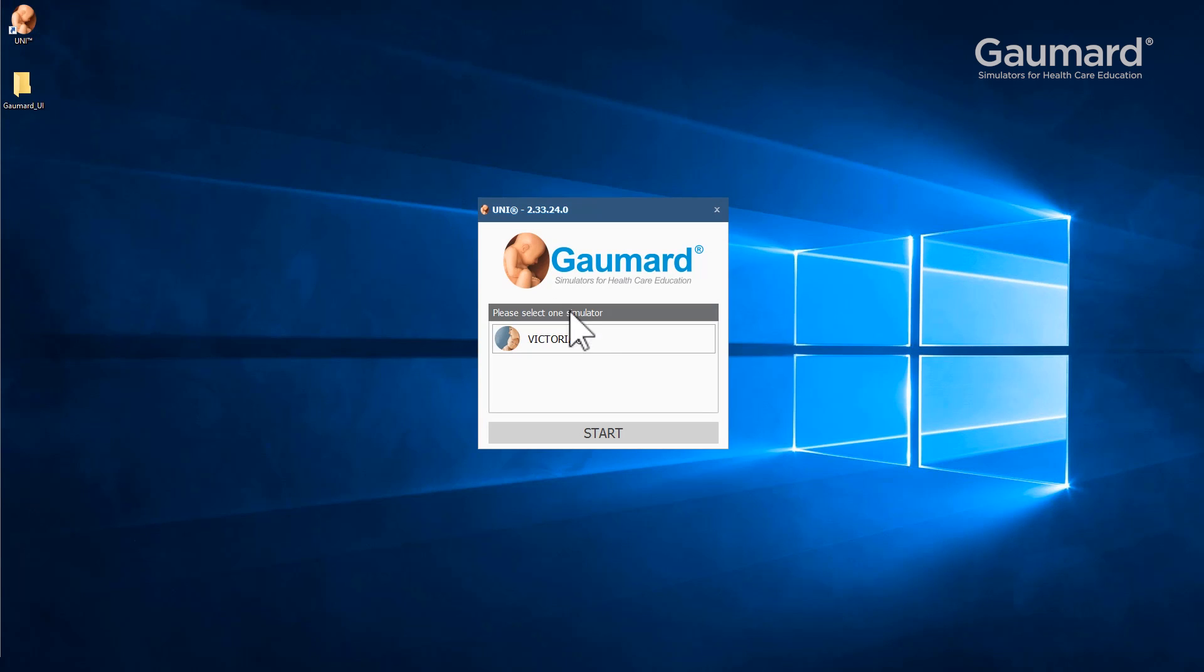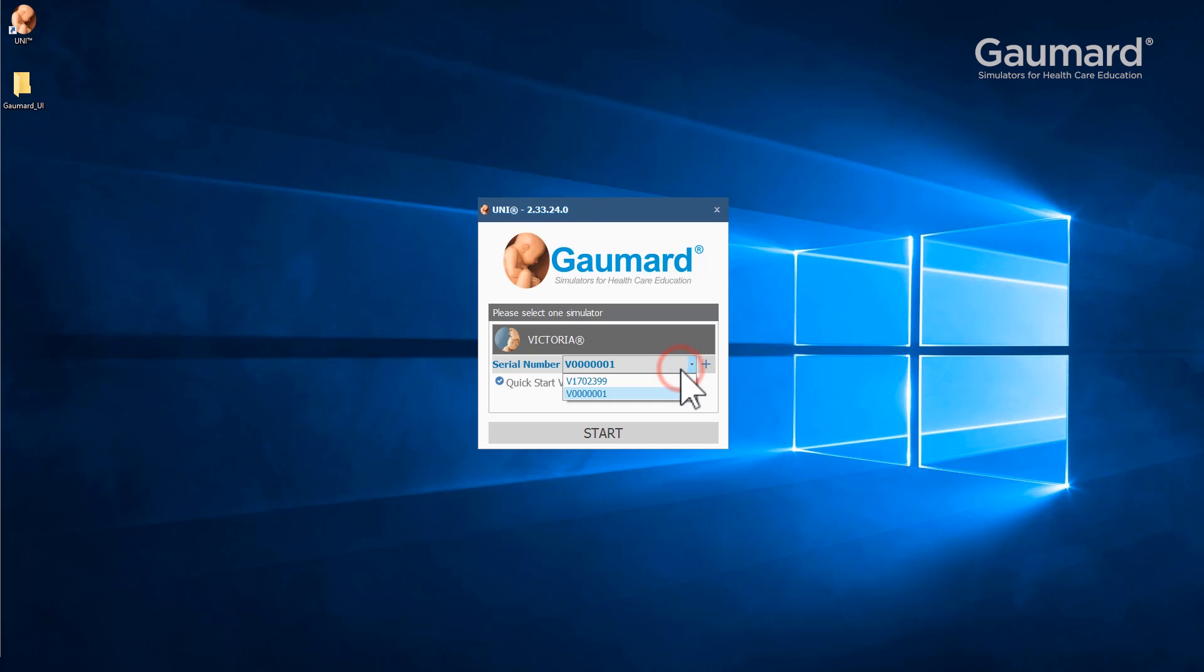Click the name Victoria, and if the serial number does not match the Victoria in use, click the drop-down menu and select the proper one. After the correct serial number is displayed in the software, click start to open the interface.